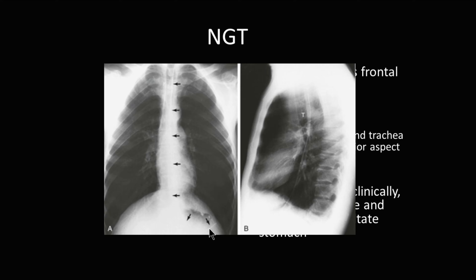The NG tube enters into the stomach. There's typically a little notch at the very end of the NG tube that allows you to note where the NG tube was placed. In fact, this NG tube looks like it's placed correctly.